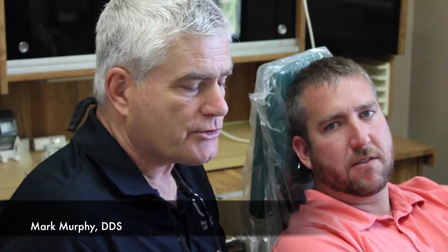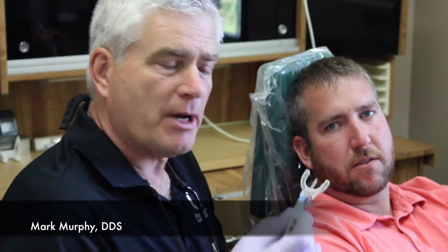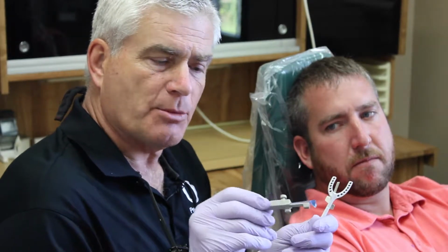What I'd like to do now is show you how to take a George gauge bite. It's the number one type of bite relationship that we get in the laboratory with these cases. There are two components here. There are bite forks, and then there's a bite fork holder, which has two little screw knobs on it. The one on the top controls the bite fork here, and the one on the bottom controls this small incisal opening for his lower anteriors.